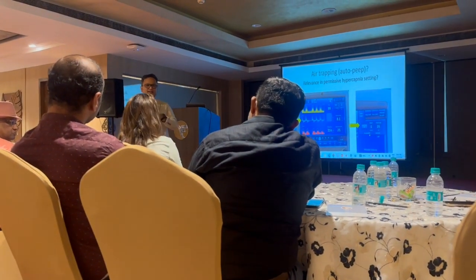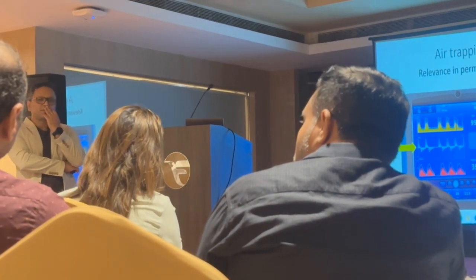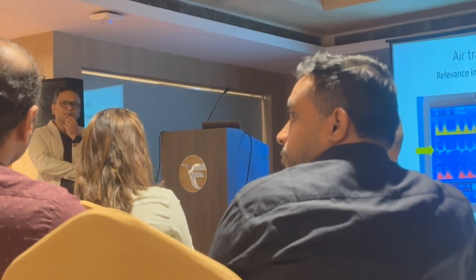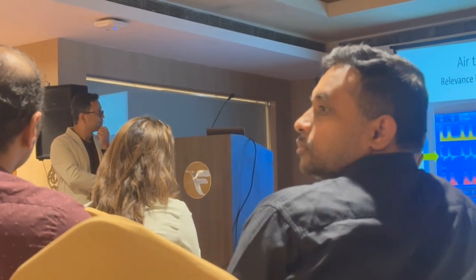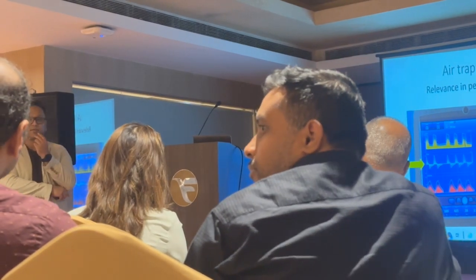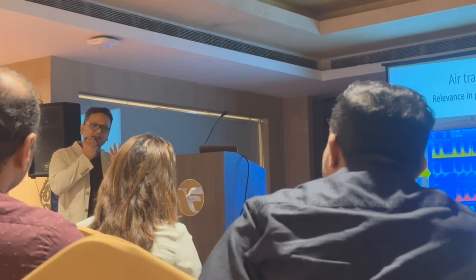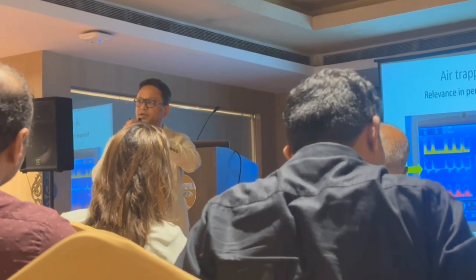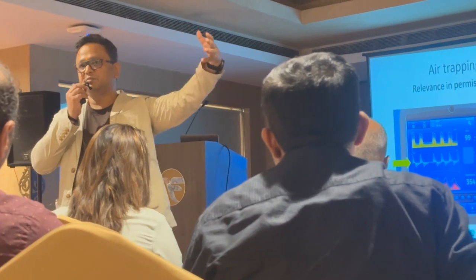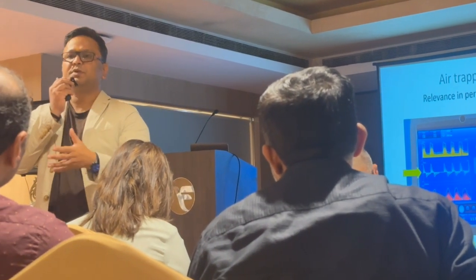Well, I think most of the things are already explained. Obviously, air trapping, we are talking about auto-PEEP. Obviously, because that is indirectly going to contribute to your pressures, and if it is there, then obviously measures have to be taken. There is something which I want to highlight for the people here. When you are ventilating an ARDS patient, you typically give more time for inspiration and less time for expiration. You actually induce auto-PEEP in there.